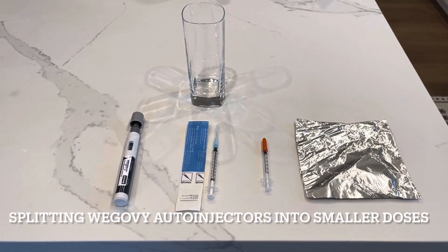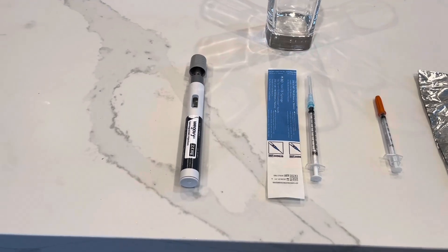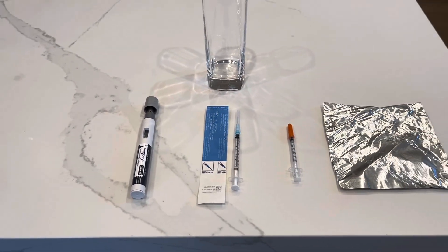Hey everybody, we wanted to do a quick video on the simplest possible way to decant the Wegovi auto-injector with the fewest number of supplies.